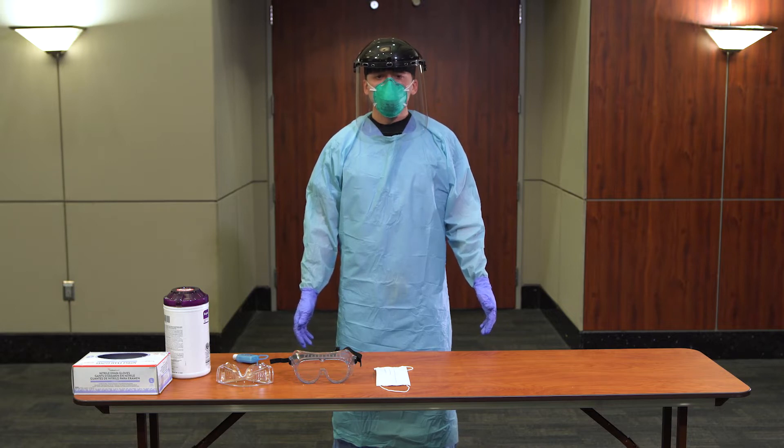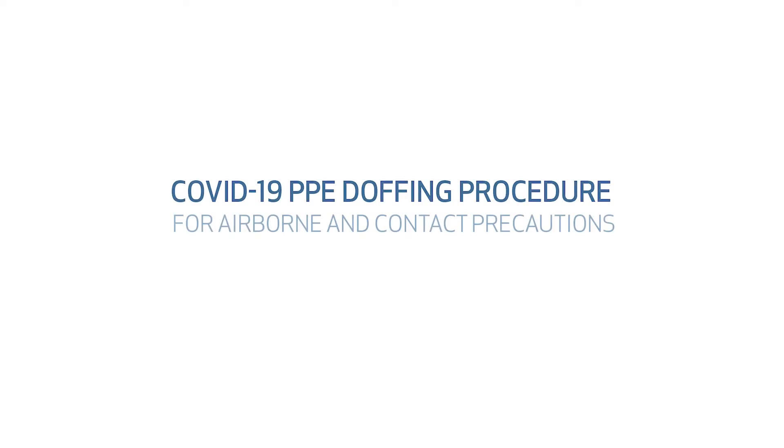Transmission-based precautions must be applied in conjunction with standard precautions. The following procedure will be used for doffing PPE for airborne and contact precautions.